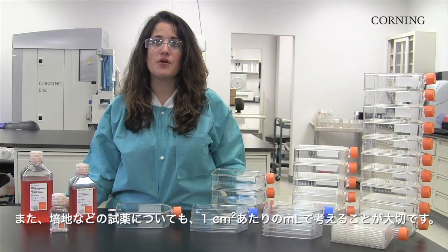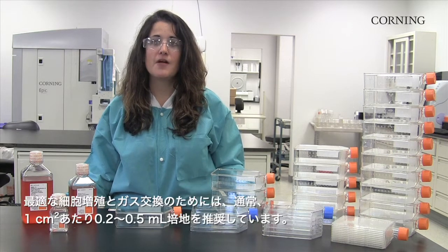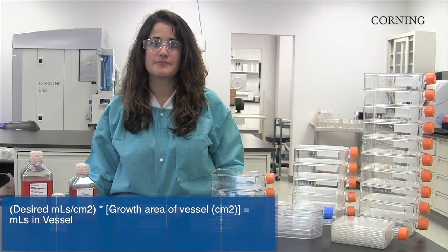It is also important to think of other reagents, such as medium, in terms of mL per centimeter squared. For optimal cell growth and gas diffusion, we typically recommend between 0.2 and 0.5 mL of medium per centimeter squared. The formula to calculate the amount of medium added per vessel is found on the bottom of the screen.